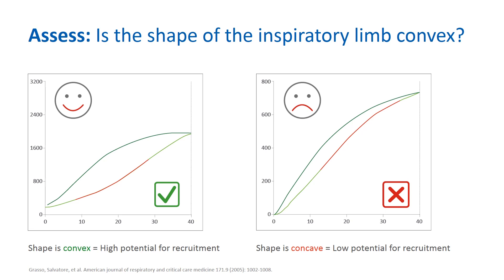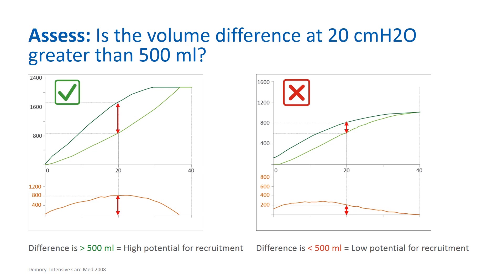To further assess potential for recruitment, a measurement of the difference in volume between the inspiratory limb and the expiratory limb at 20 centimeters of water pressure is required. To view this difference, touch the PV tool graphics panel and select the pressure over volume plus pressure over delta volume, or DV graph option. Following this, select cursor 1 and turn the PNT knob to the right until the cursors are set at 20 centimeters of water pressure on the x-axis. From here, you can directly measure the difference in volume using the plot below the curve or the direct measurement on the right side of the screen.